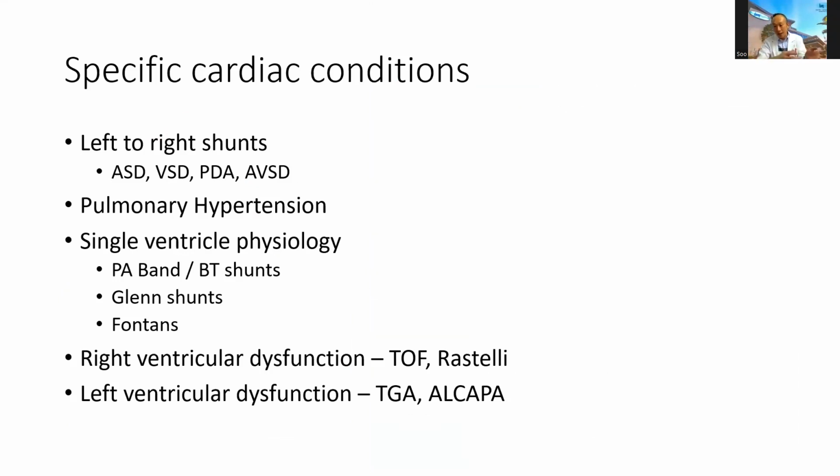At the bedside, let's say you want a tidal volume of 8 mils per kilo, but if you're using a PRVC mode, you find that for 8 mils per kilo you need a pressure of 22. But if you're trying to treat the right heart, you don't want so high pressures, you can increase the I time longer to give more tidal volume at the expense of a lower peak pressure. So that is how we play at the bedside.